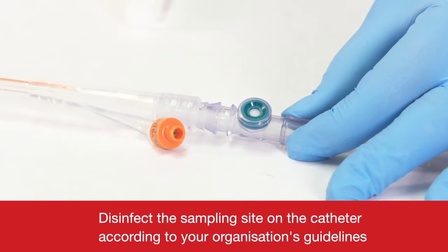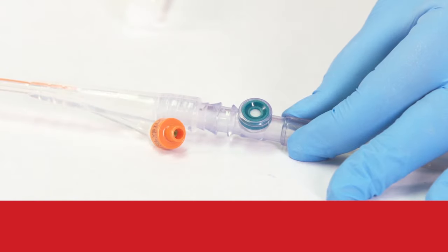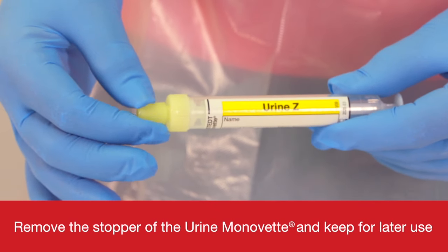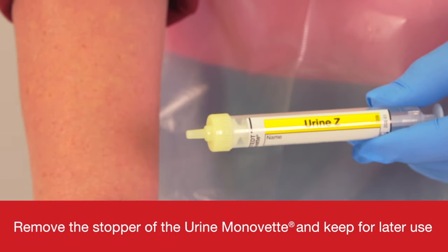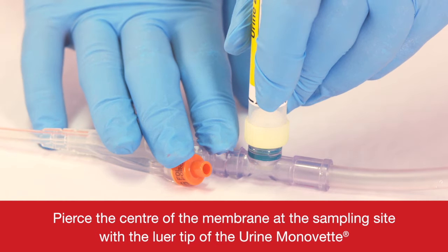Disinfect the sampling site on the catheter according to your organisation's guidelines. Remove the stopper of the Urine Monovette and keep for later use. Pierce the centre of the membrane at the sampling site with the lower tip of the Urine Monovette.